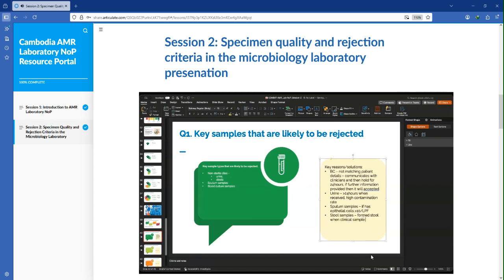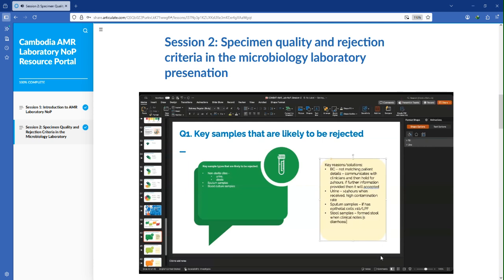So other than diarrheal stool, we reject it.